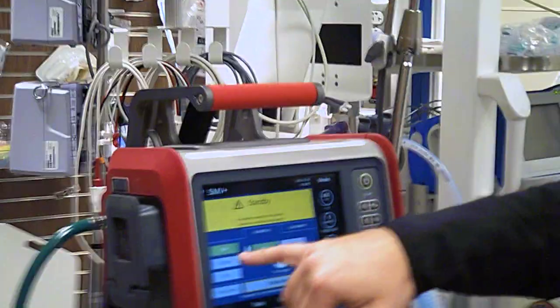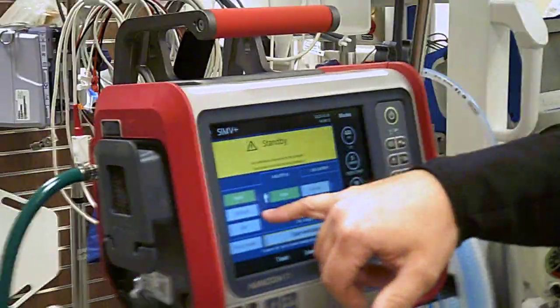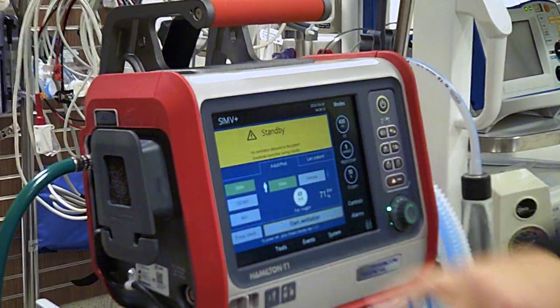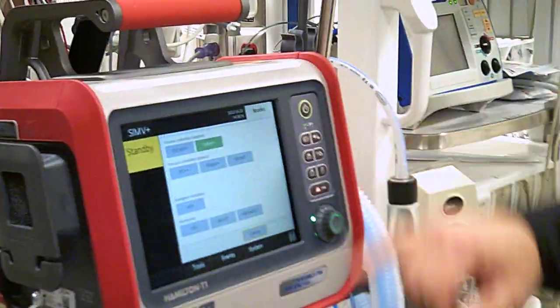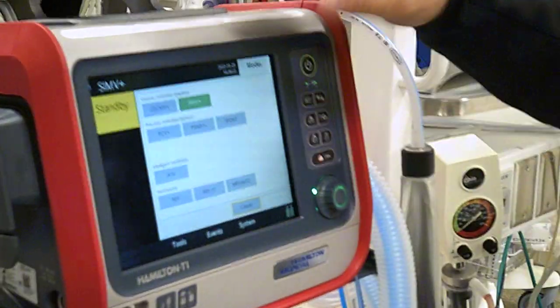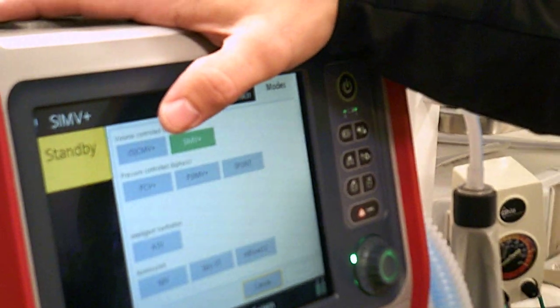So currently right now in your quick settings you have SIMV volume, you have CMV volume, and you have non-invasive. If you hit modes up at top, there we have it. So remember, I told you guys in the last video the CMV. On an original vent, that would mean I would set a rate of 12 and 500, and that's what I'm going to get.